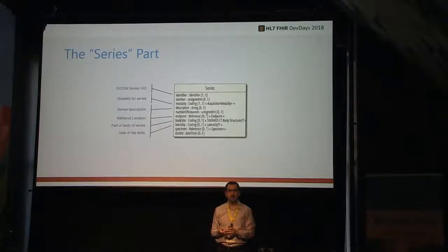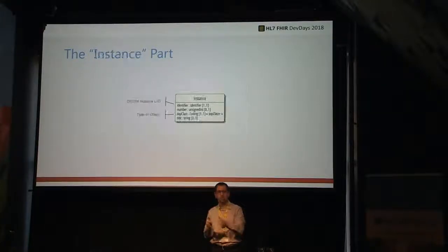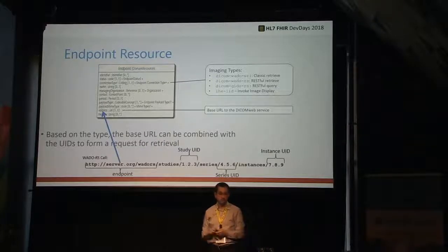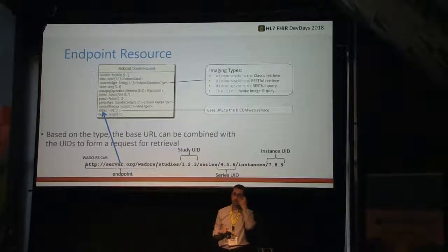I mean, I could answer the question in many different ways. One of the ways is they're, of course, trying to slowly standardize this so that it can go into DICOM. But of course, until we get there, we have to deal with the reality that, yes, most of them are in proprietary formats right now. So I would imagine that you probably could just do what you suggested. You could just stuff it into an imaging study and then have an endpoint, which is the IHE IID that just takes you to the viewer right away. Okay, any other questions before we move on?